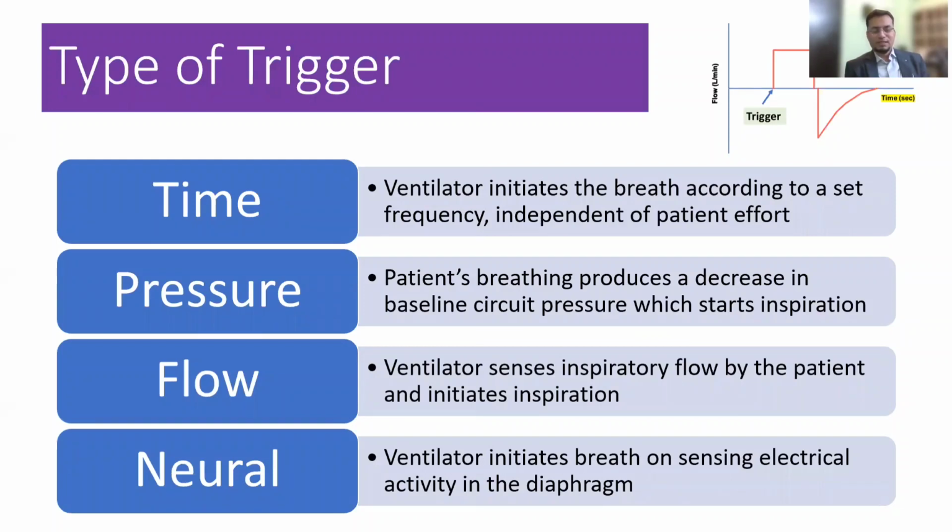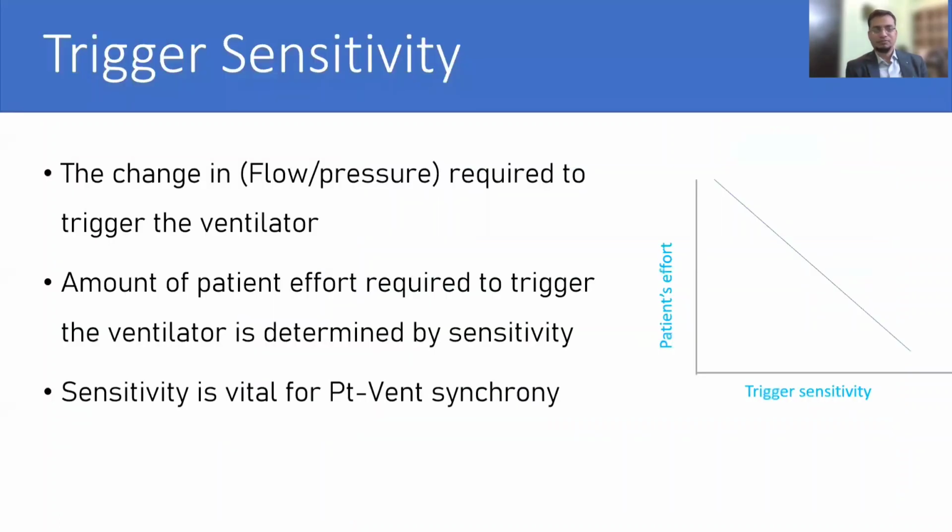Now, what are the types of triggers I was telling? There may be a time trigger, pressure trigger, flow trigger, or neural trigger. I'm not going into detail of this because we have learned it already, I think.